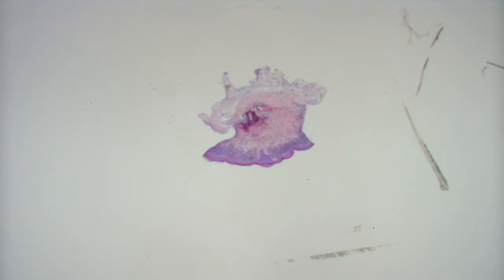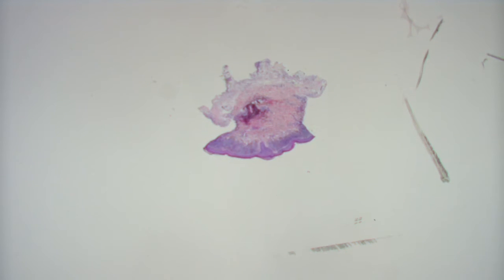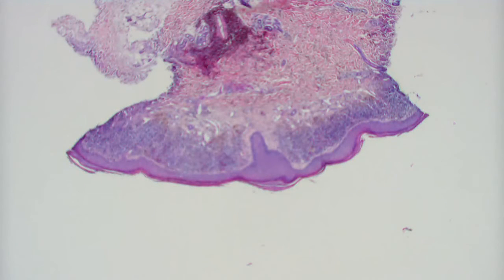So we have a punch biopsy. It looks like there's a lichenoid infiltrate. Yes. But that's not the only thing. So it's predominantly lymphocytic. There's a lot of red blood cell extravasation. Good. What part of the body are you on here? I thought it was lower extremities because of, good.